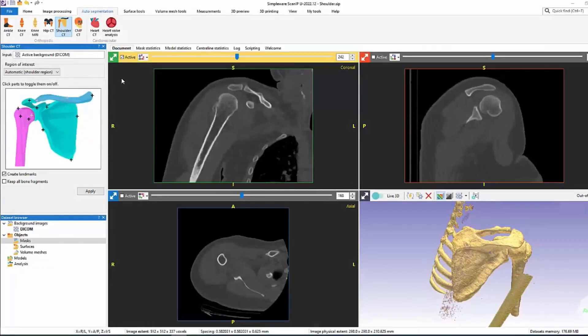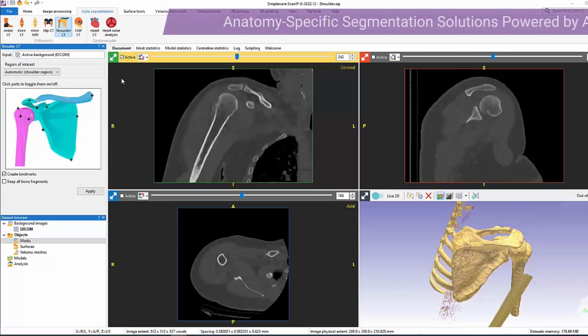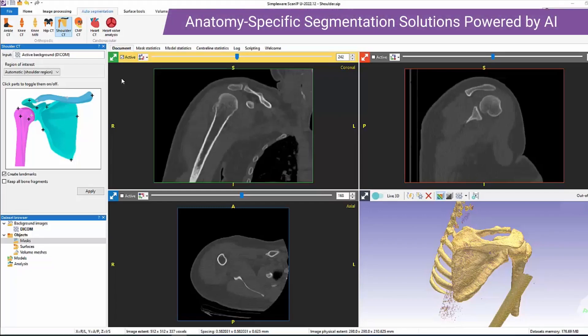Welcome to this video on the recent additions to ASOrtho, one of the automated segmentation modules available within Simpleware Scan IP. For those of you who haven't come across ASOrtho before, this module contains several automated and anatomy-specific segmentation solutions. These are powered by AI technology using machine learning algorithms, and segmentation of these anatomies can be a laborious process that occupies significant engineering resource and time.